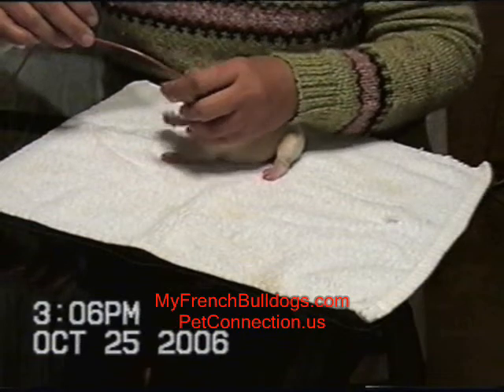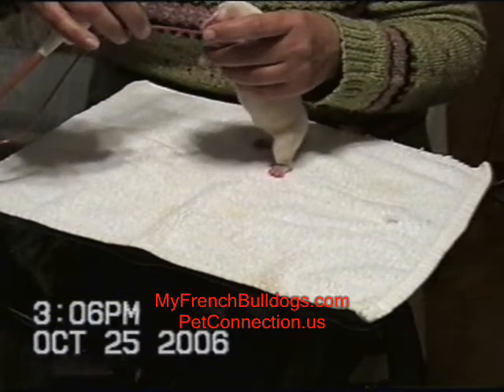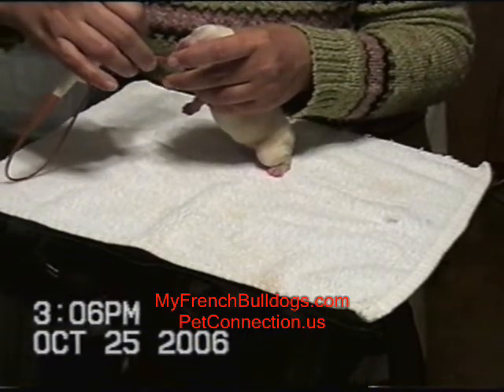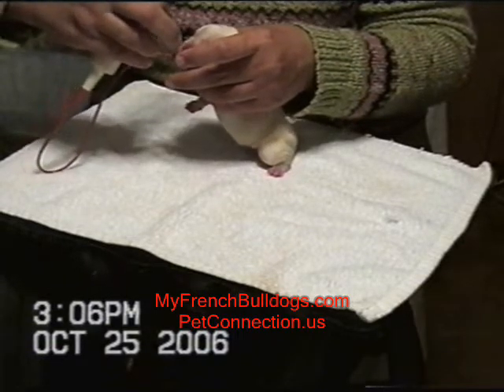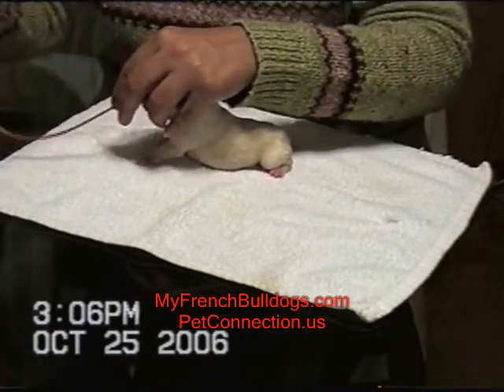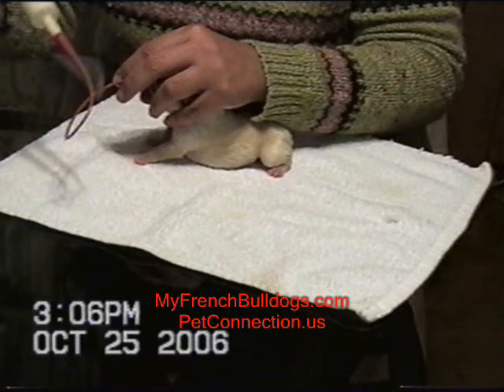It's a little tricky when it starts going down to keep up with exactly where that mark is, so it's better to mark it with a magic marker. It also helps if he will start attempting to suck on the tube. Sometimes they do, sometimes they don't, but when they do, it makes it a little easier going down. If he keeps a natural position of his head, it also helps the tube to go down a little more easily. If you start feeling resistance, pull out and go back again. You don't want to stab anything, and if it's going down easily, it's going to the right place.